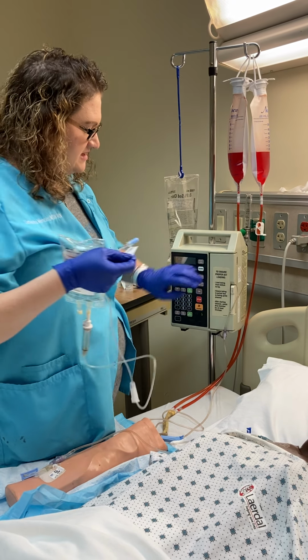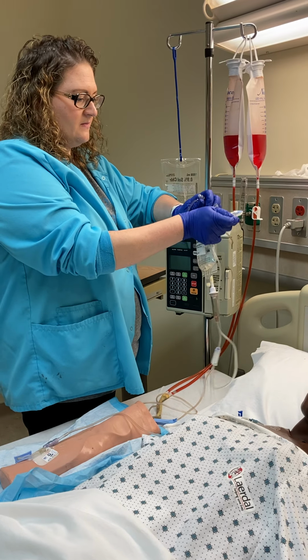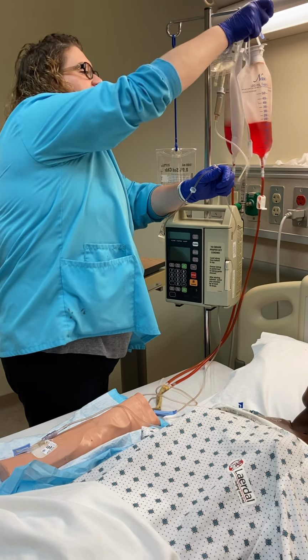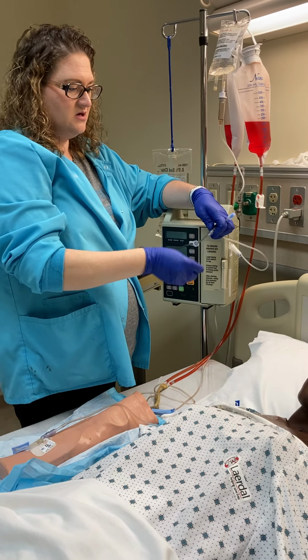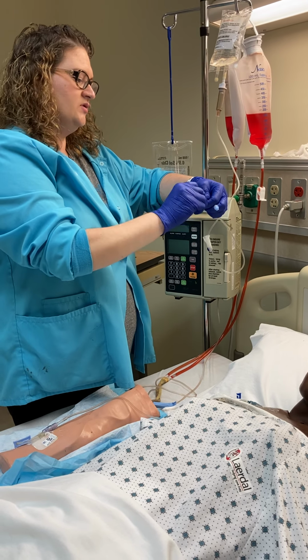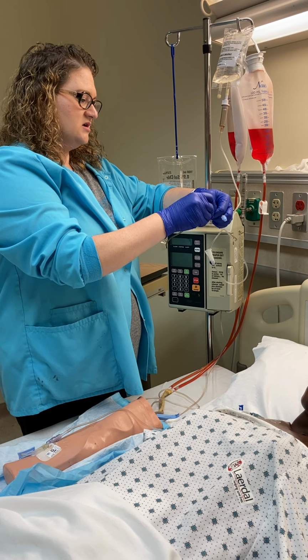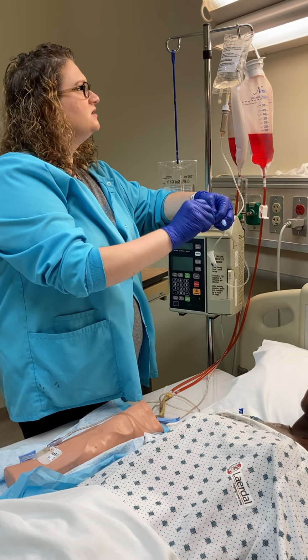I have my pump stopped for right now. I'll hang that up there for a second. See, I didn't prime my line at all because I'm going to back prime here. So I'm going to clean for 15 seconds and then I'll allow it to dry.